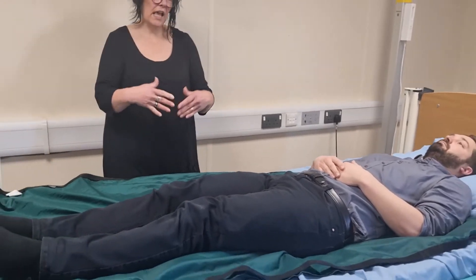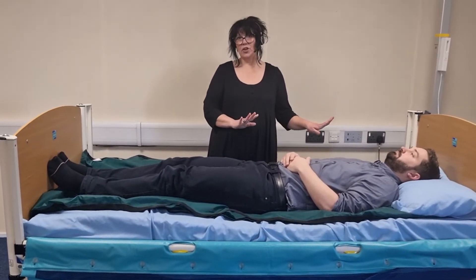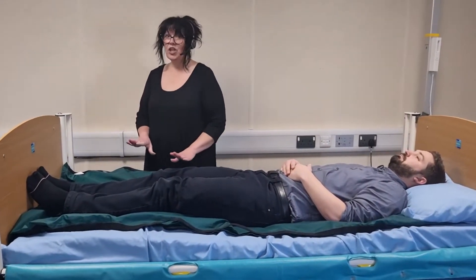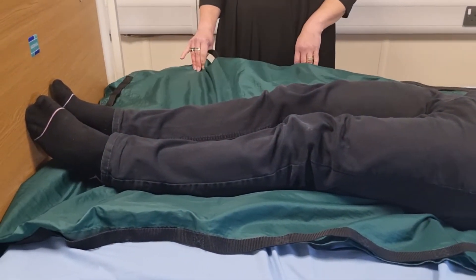The slide sheets are now fitted and we're ready to reposition the person in bed. We don't leave slide sheets in place, so once we've repositioned we need to remove them.